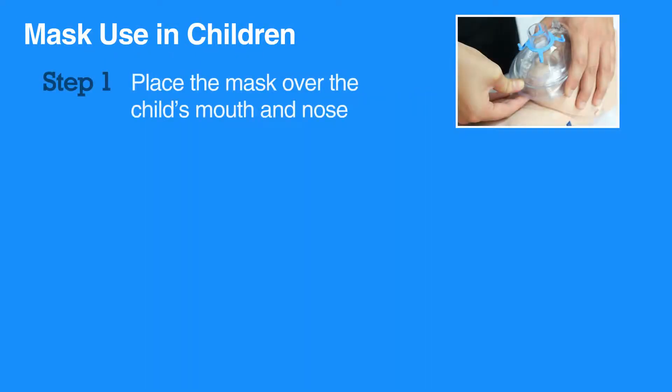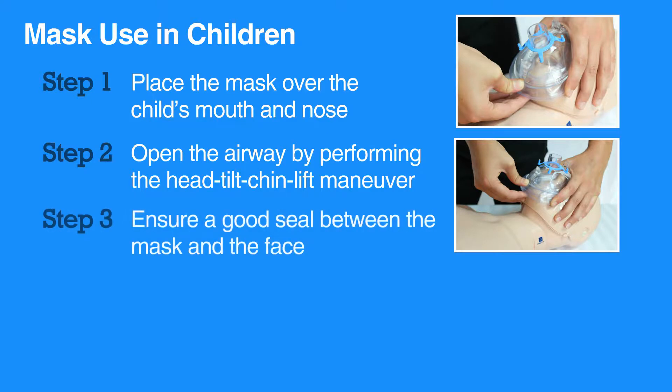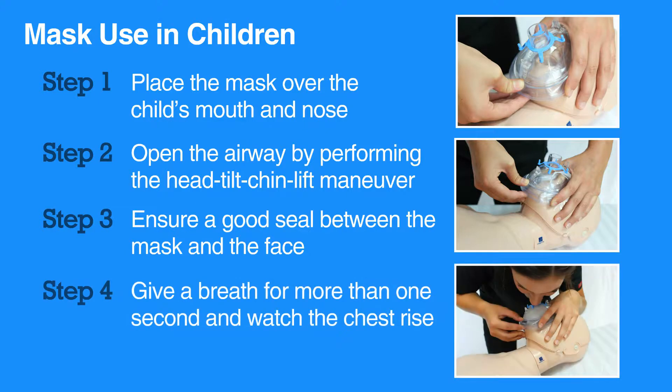To give breaths using a mask, first place the mask over the child's mouth and nose. Then, open the airway by performing the head tilt-chin lift maneuver. Ensure a good seal between the mask and the face. Give a breath for more than one second and watch the chest rise. Deliver the second breath.